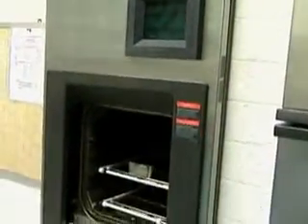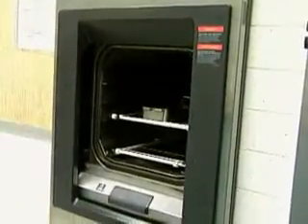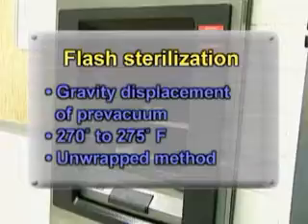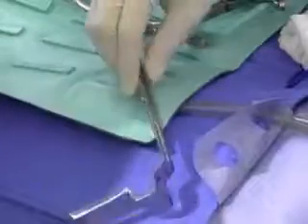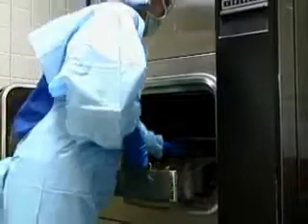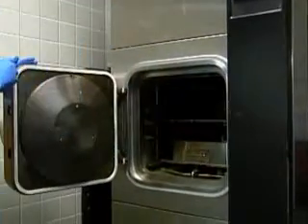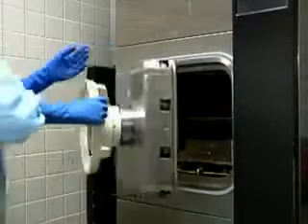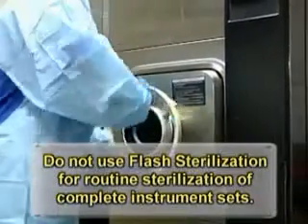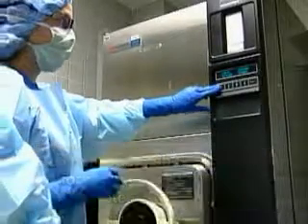Flash or high-speed sterilizers may have either a gravity displacement or a pre-vacuum cycle and steam sterilize between 270 and 275 degrees by the unwrapped method. The flash method should only be used during urgent, unplanned, emergency situations, or when the surgical suite has been specifically designed to incorporate flash sterilization of instrumentation. Flash sterilization should not be used for routine sterilization of complete instrument sets.